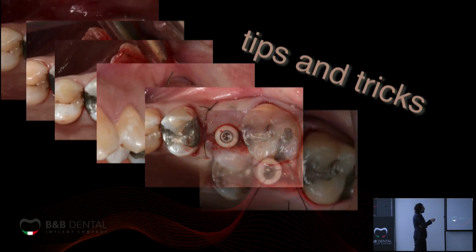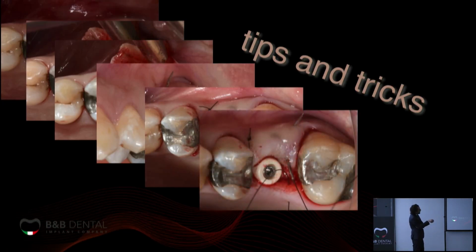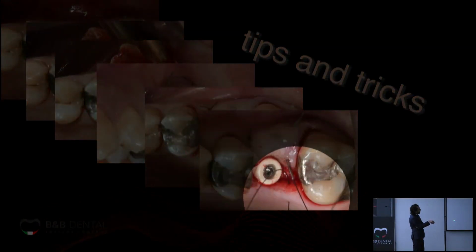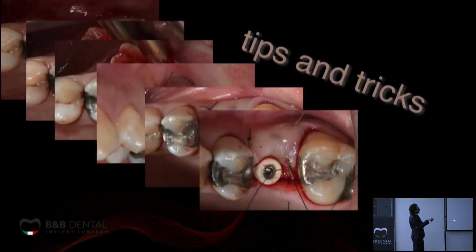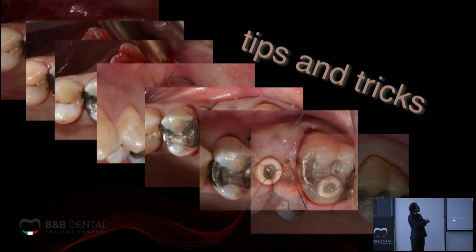So we tighten the mesial knot, and here you can see better how the suture is done: you enter from the external aspect of the palate, and then you take the flap like you want to apically reposition the flap.